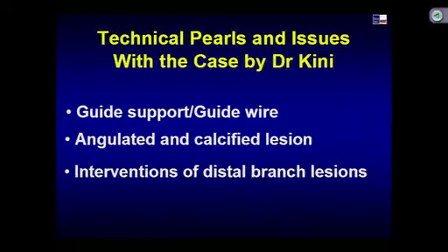would be easy, but more difficult is how we are going to do the rotational atherectomy through the stent struts into the PDA, that we will have to do the dynaglide, and doing dynaglide means you have to bring the burr from the mid RCA to distal RCA will be a special dyna technique. So, there technical aspect will be how your burr pull push have to be done, which we will show how exactly you will bring the burr to that particular area.